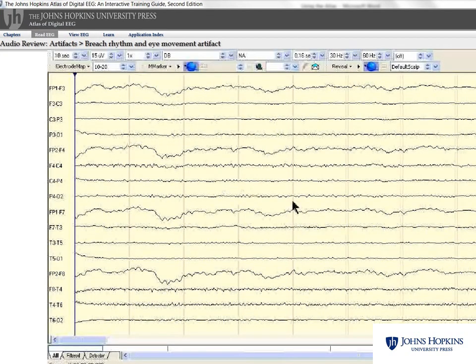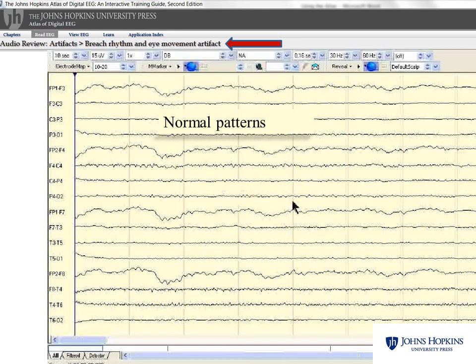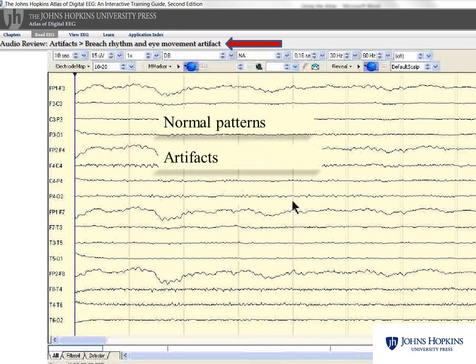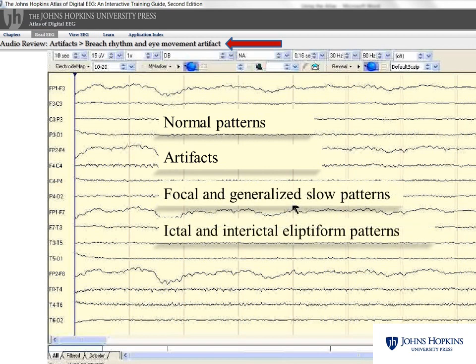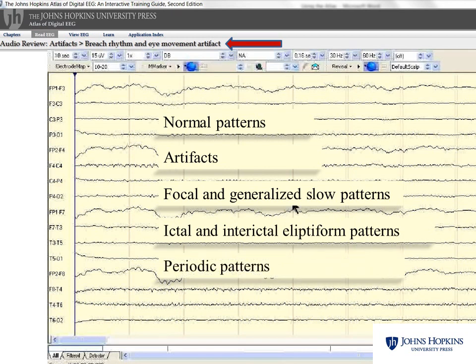Expert electroencephalographer Dr. Peter Kaplan narrates an extensive audio EEG tutorial on how to read 24 common and important EEG patterns, including normal patterns, artifacts, focal and generalized slow patterns, ictal and interictal epileptiform patterns, periodic patterns, and normal and abnormal pediatric patterns.